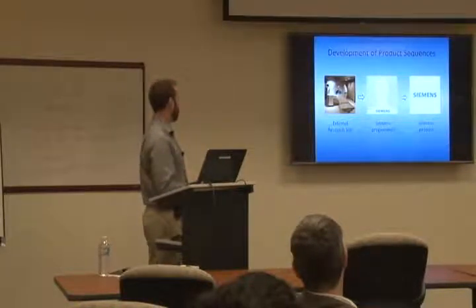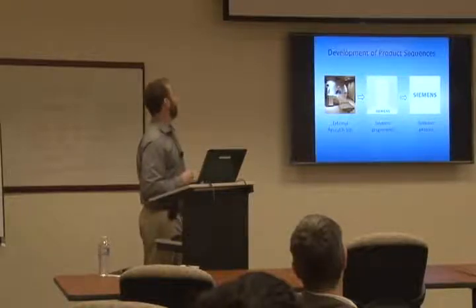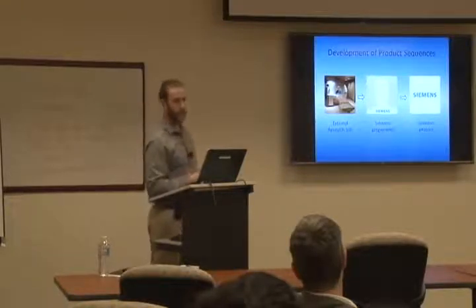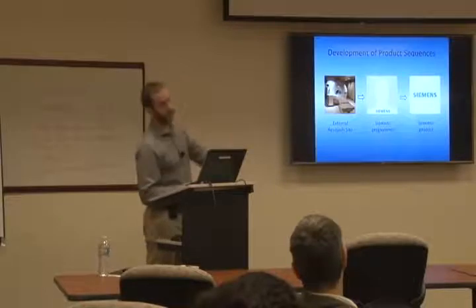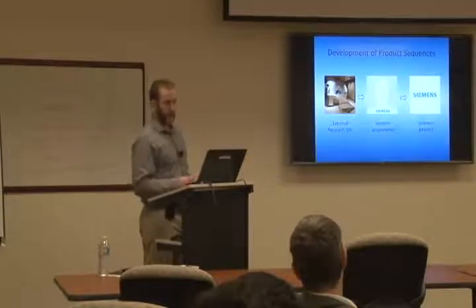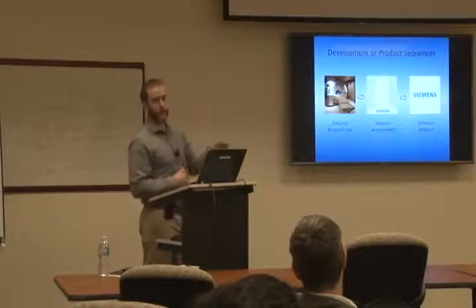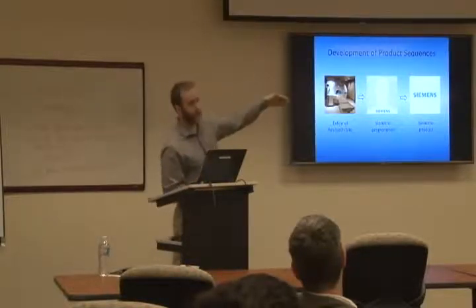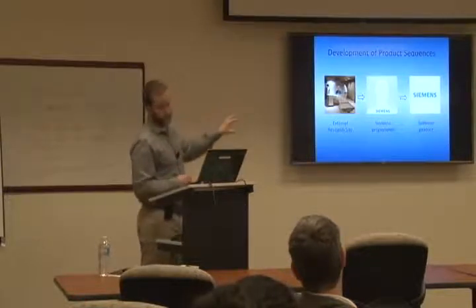And then the programmer is going to build up the sequence, and he's going to be working with customers, making sure the sequence works just fine, there's no issues, no bugs. And once it's at that point, it becomes a Siemens product. And that can take a long time to go from the first one to the last one. And so what you're getting on the scanner is the last one. And really, you have the most flexibility in the first two.